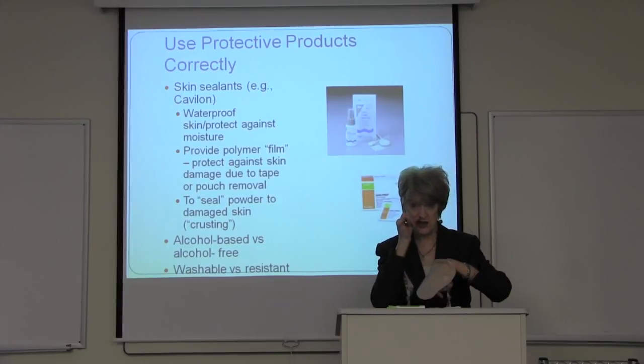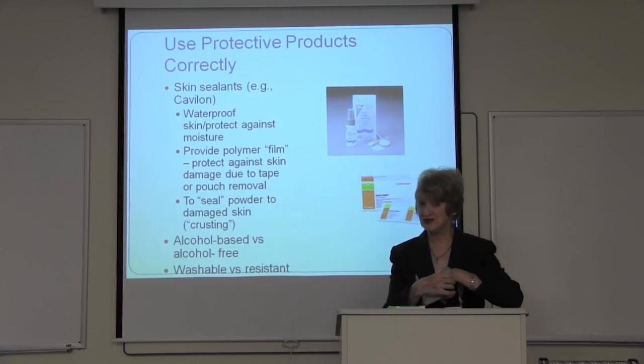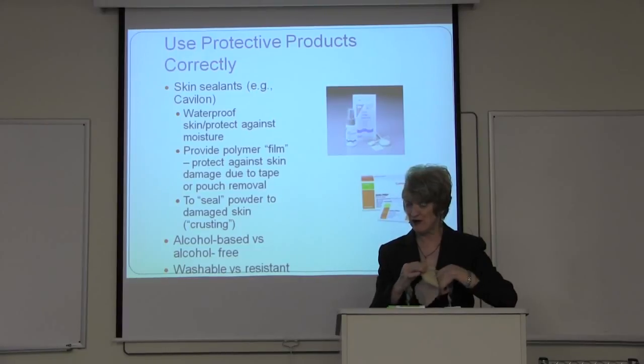So they're really designed to adhere to clean, dry skin. If I put a plastic film on the skin, it can interfere to some extent with the barrier's ability to melt into the grooves of the skin. However, as you will see when I go to pull this off, it still sticks pretty darn well.